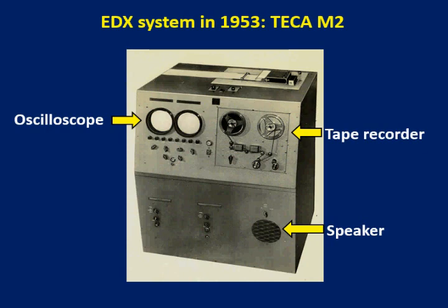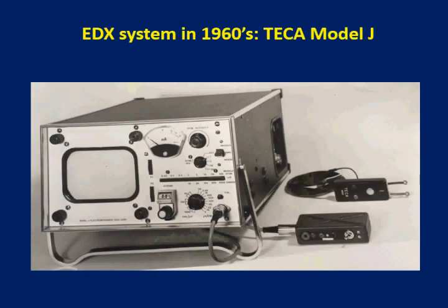There is no stimulator. When the usefulness of nerve conduction studies was demonstrated, the electrical stimulator became an essential component of the system. Here is a system from 1960s with a black stimulator handle that was used until just 10 years ago.